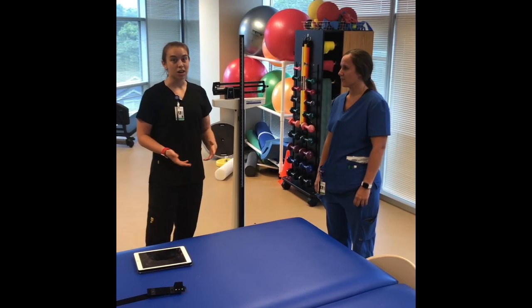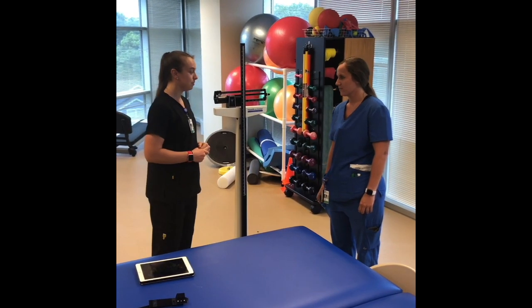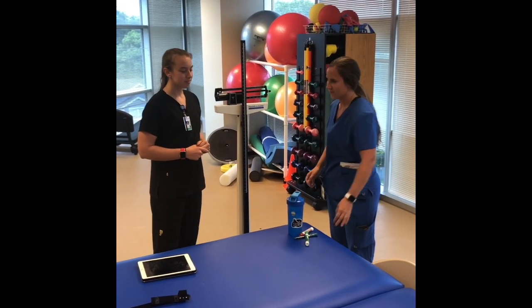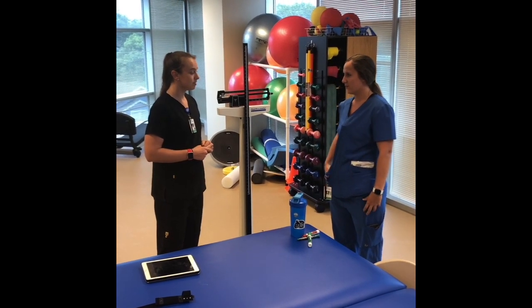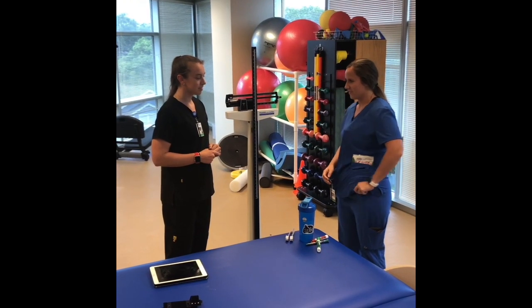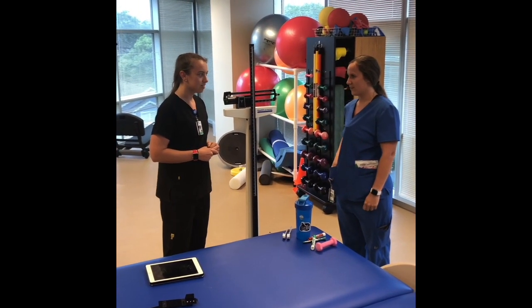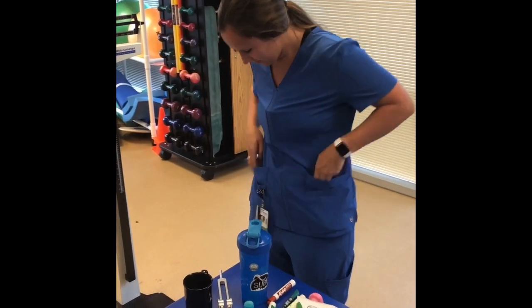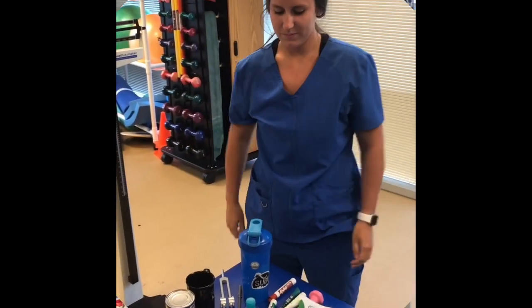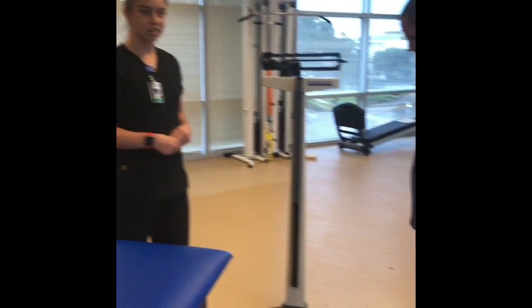For the weight assessment, first step you want to do is have your patient remove everything from their pockets. Is that everything? No. Is that all? No. Now that everything is out of the pockets, next step would have the patient remove their shoes and socks.